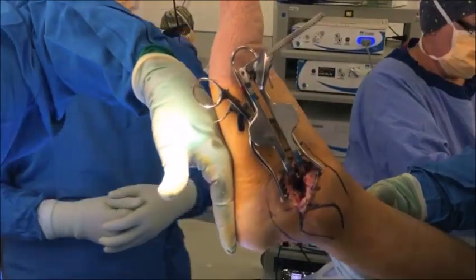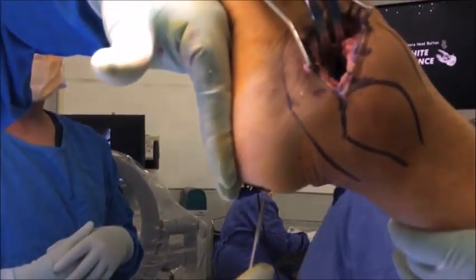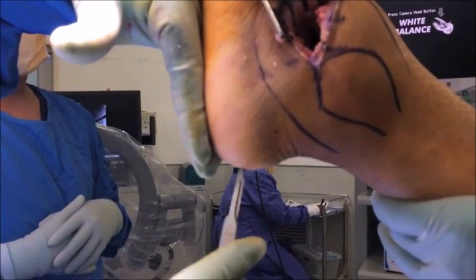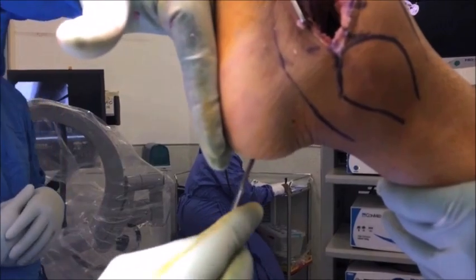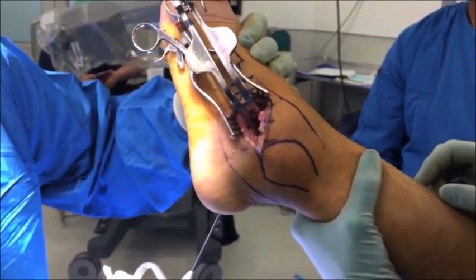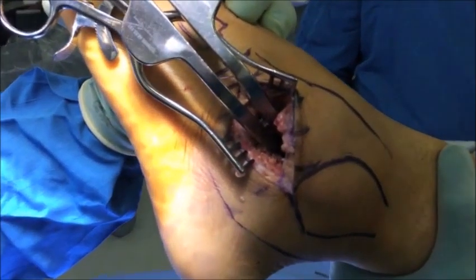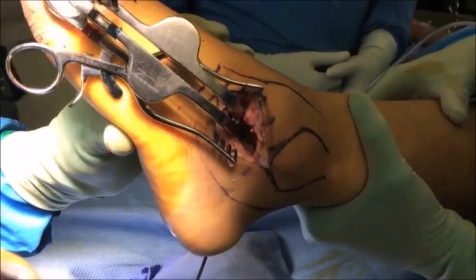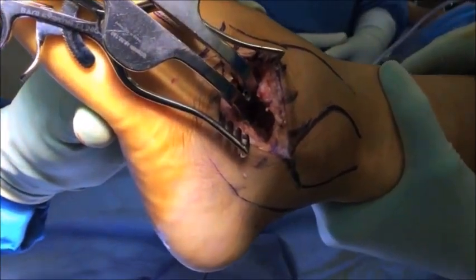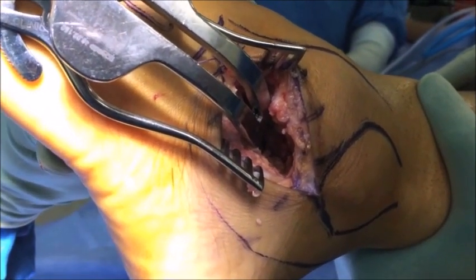We are now ready to insert the hardware fixation. The screws are inserted through the posterior aspect of the heel. It's very important to make sure that these are inserted off the weight-bearing surface. Here we can see a hand placed on the plantar aspect of the foot and the incision made proximal to it so as to avoid the hardware being on the weight-bearing surface. The lamina spreader has been left inside so that we can visualize the placement of our K-wires. The first wire is placed in the lateral half of the calcaneus, aiming into the mid-substance of the posterior facet.